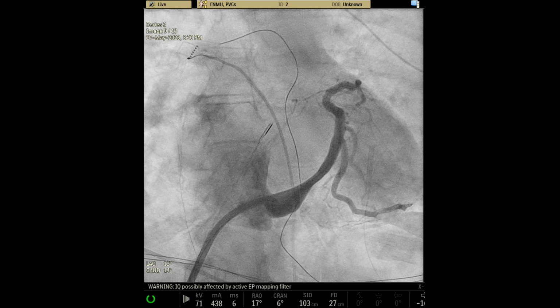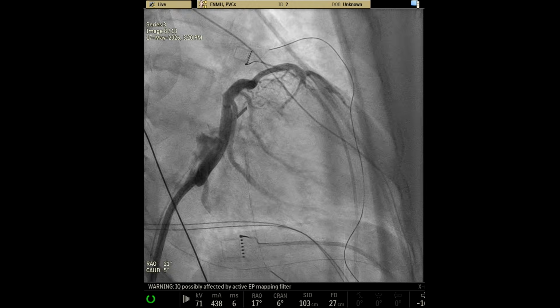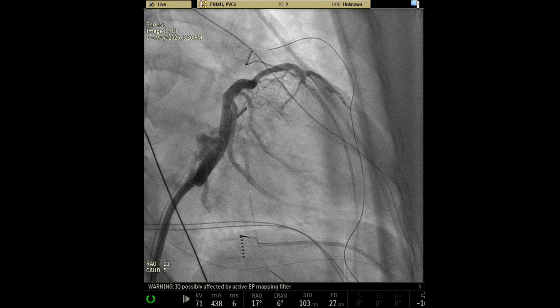We can also see, because we might be interested in mapping the septal perforator, there is one septal perforator, two septal perforators, and maybe a very tiny LV annular branch. And the second step is one image on LAO, so next one, and RAO. Okay? Next one in RAO, you can see, play that please, and you can stop it somewhere in there. We have, again, a good curve, and if you stop there, where you have the branches, just stop. So there you have, you know, those big ones are lateral branches, so you're looking at the tiny ones. Now, this could be good for a guide wire. Something bigger is not going to fit if we're interested in mapping the septum.